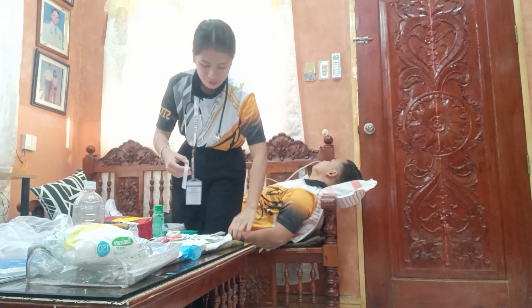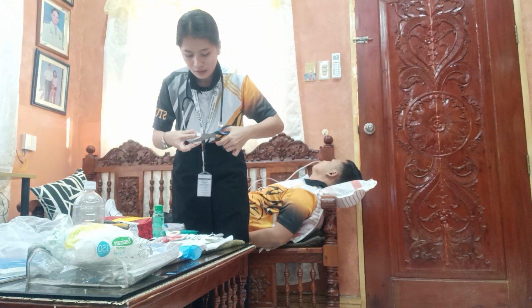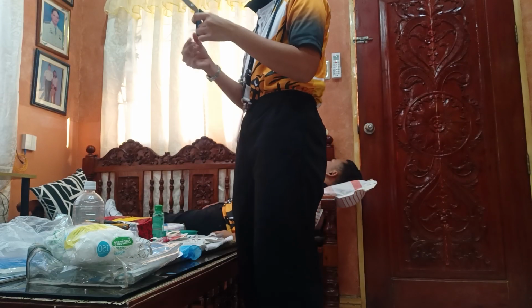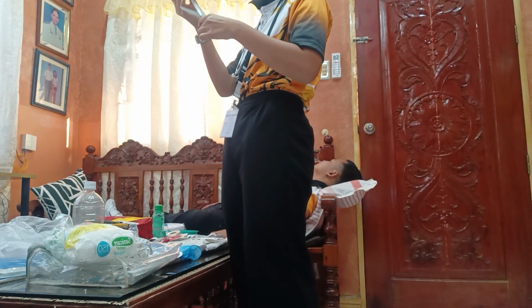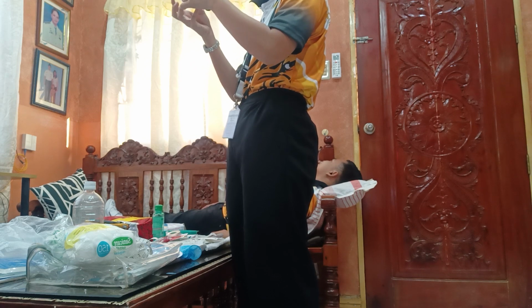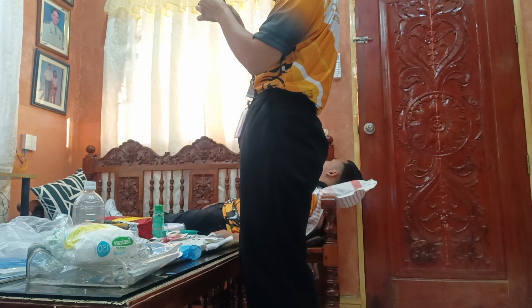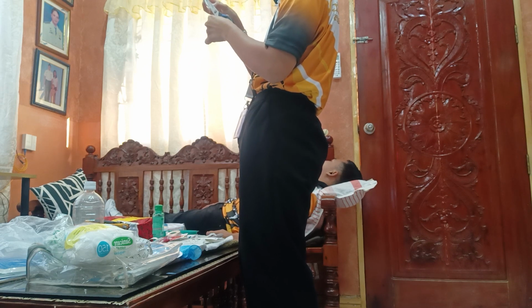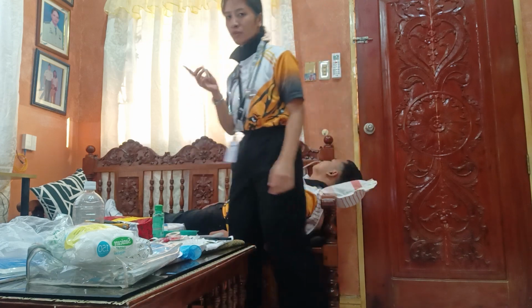Lumita po ako dito. And after that, after magupit, ito po is hatiin po sa may gitna. Okay. And after po nun, isi-secure ko pa po mabuti.